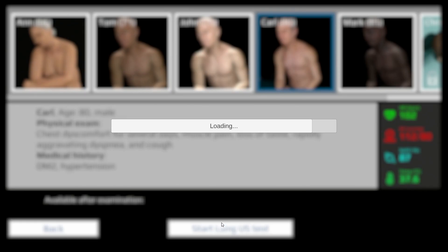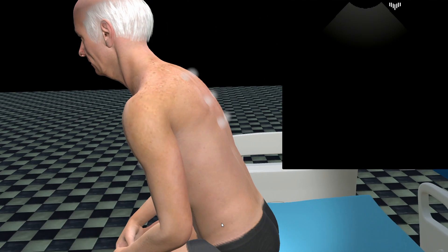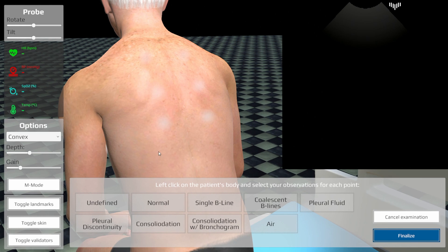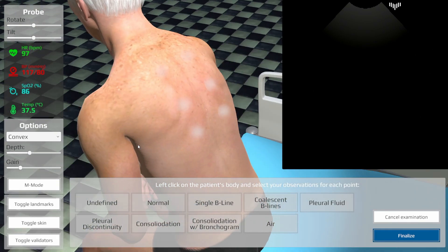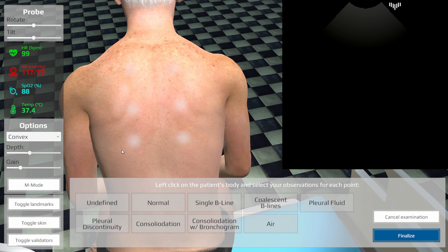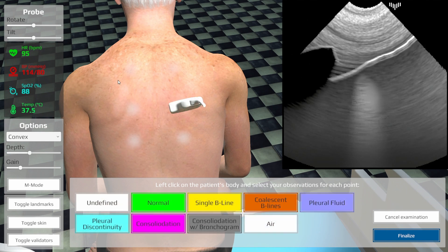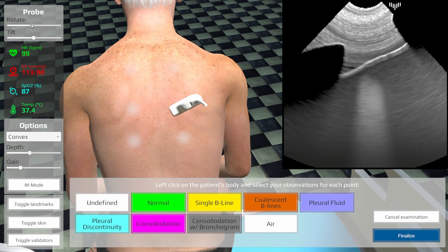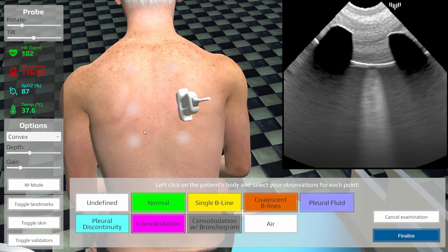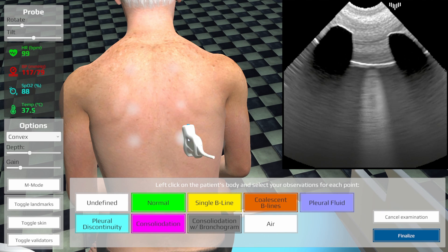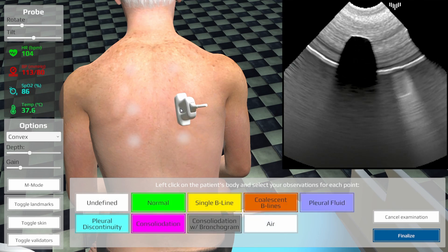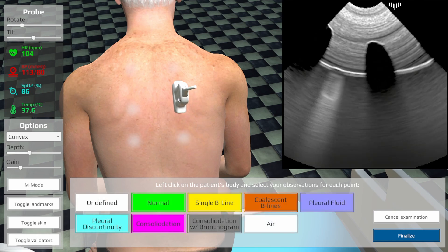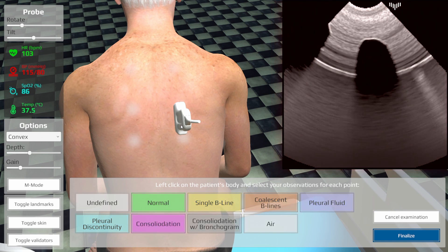After a click, the 3D view is loaded. You can rotate the patient by dragging the mouse with the right button pressed down. Select the standard LUS scanning points. The probe can be positioned anywhere on the chest by clicking on the model, or you can drag the probe over the chest and observe the image in the right upper corner.